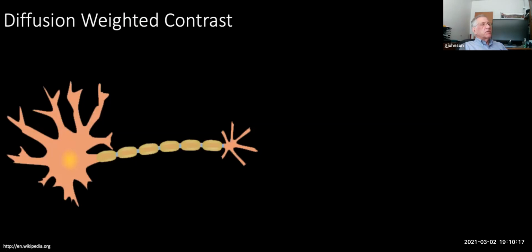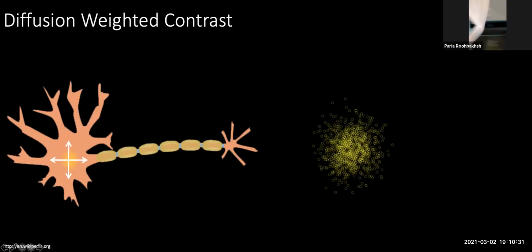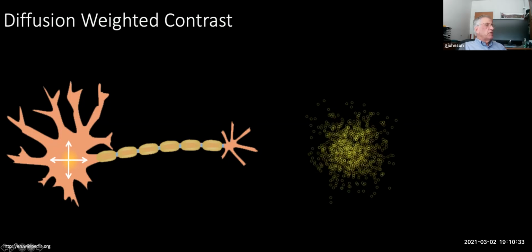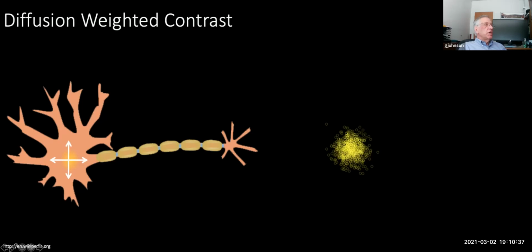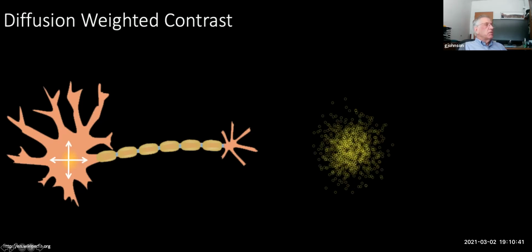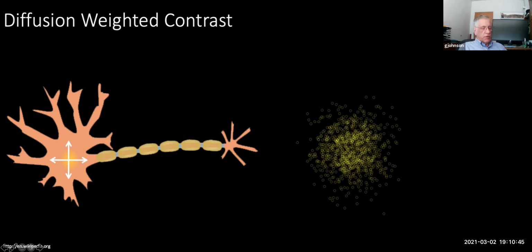The reason these gradients are important to us is because we are doing a lot of our work now with diffusion weighted imaging, diffusion tensor imaging. And again, I'm giving just a brief introduction to it, but normally in the cell, for example, where spins can diffuse randomly in all dimensions, you will get a diffusion that is also random, and the signal will not be dependent upon any gradients that you supply.